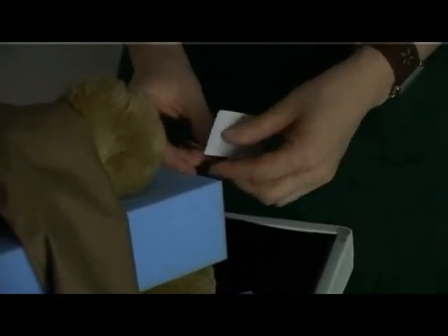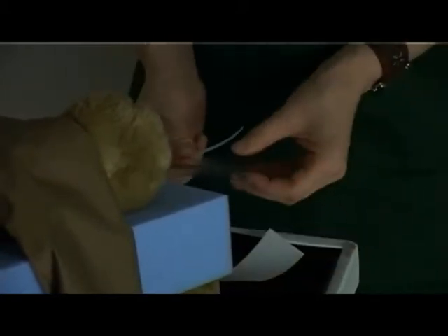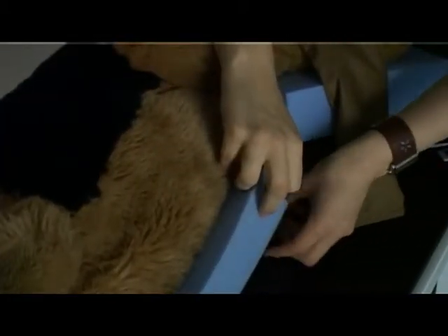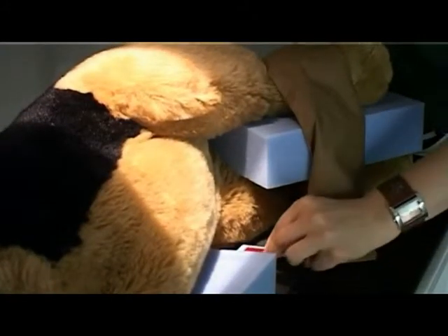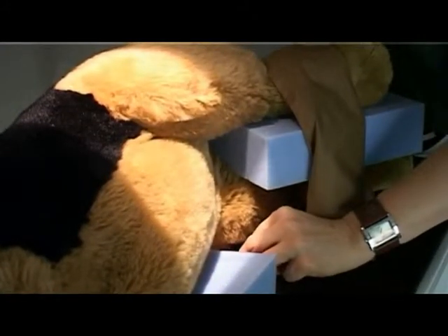Label with the patient identification and date and place this within the primary beam. Place the right marker also within the primary beam. You have now correctly positioned the patient for a right lateral cystogram, including all the necessary equipment.